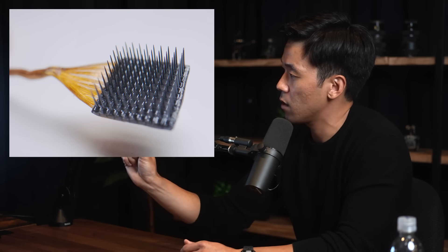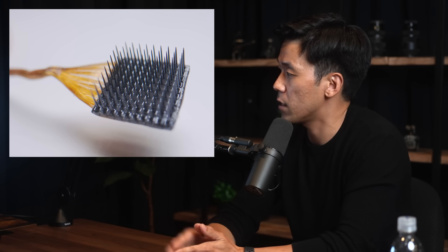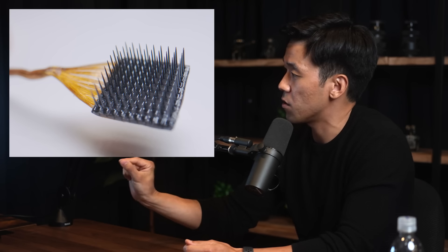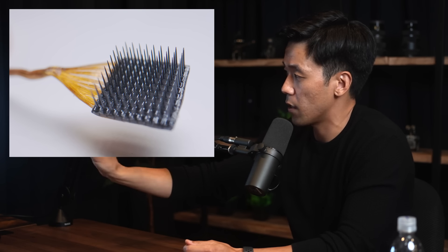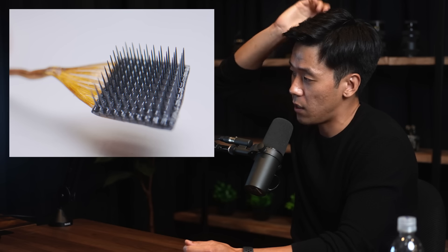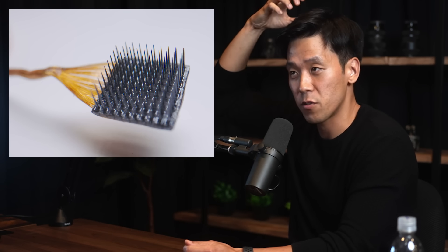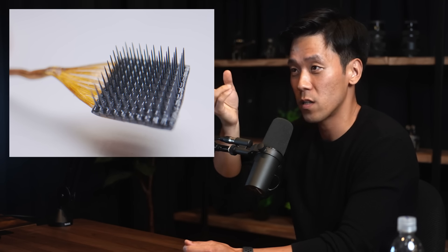Unlike Neuralink threads, which have iridium oxide recording sites along the depth, the Utah Array records at only a single depth — the spokes can be anywhere from 0.5 to 1.5 millimeters, with slanted designs for different depths. A key difference is there's no active electronics in the Utah Array — these are just electrodes with a bundle of wire that exits the craniectomy to a port you can connect external devices to. That through-skin port is one of the biggest failure modes for infection.